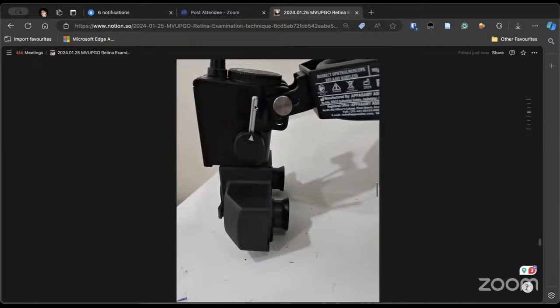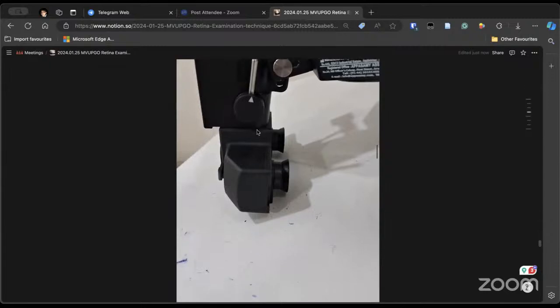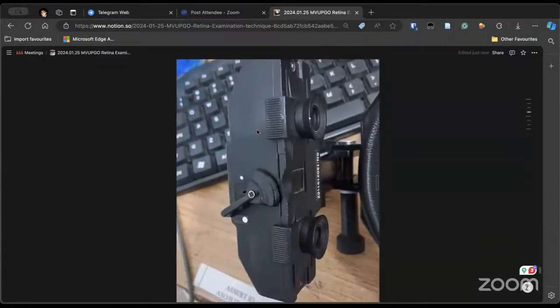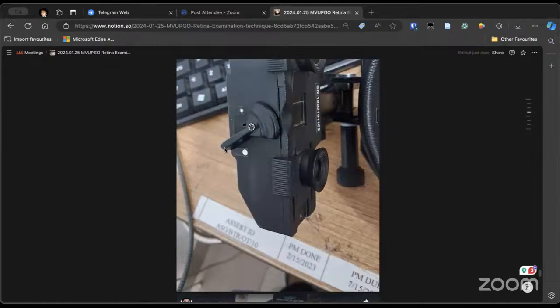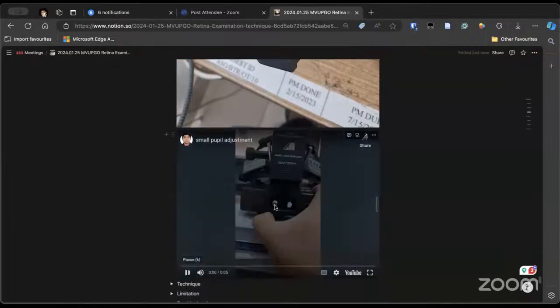See, this lever is reducing the beam size, like the diameter of the beam. What does this do? This concentrates all the beam into a smaller area. Yes. So what it will do, I have just kept this.